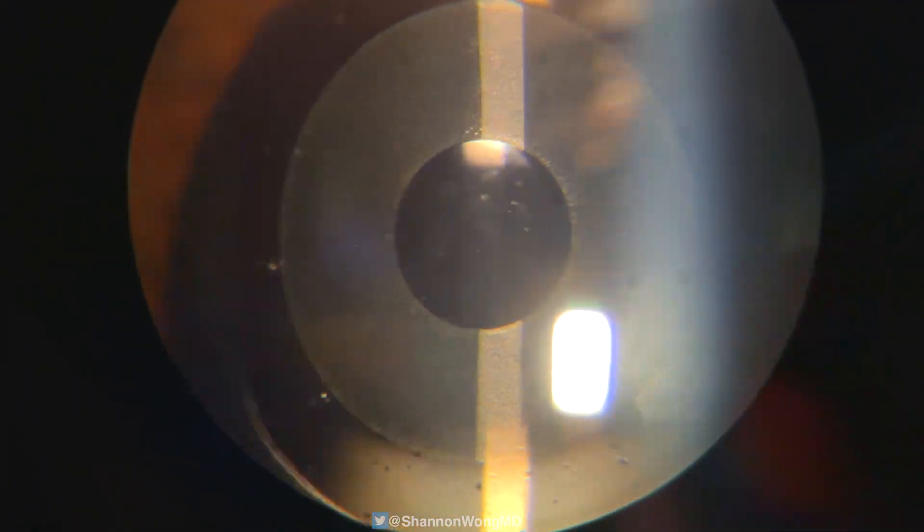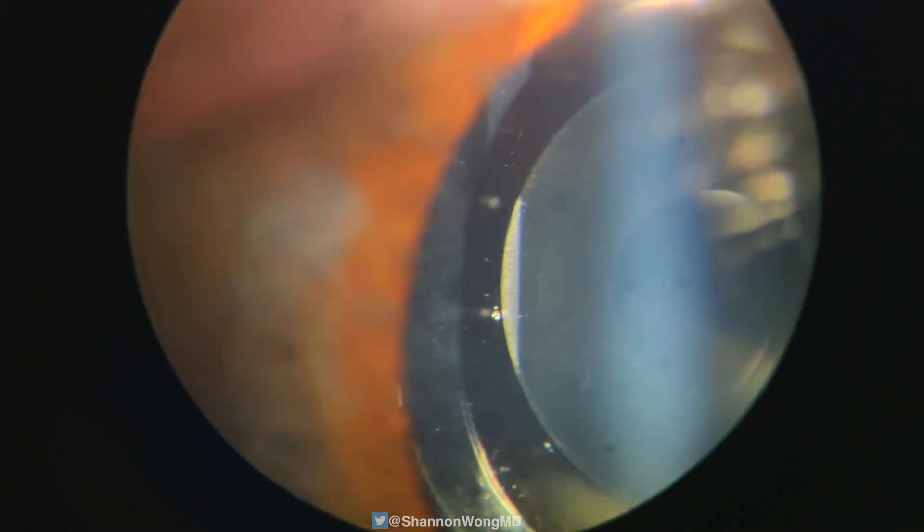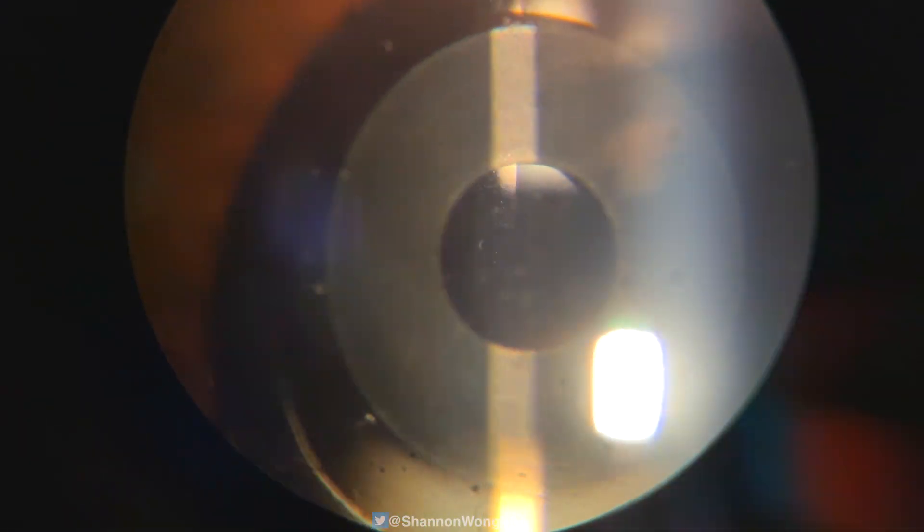By connecting the YAG laser spots in a large circle, which then falls into the vitreous, the central opaque capsule is cleared successfully.